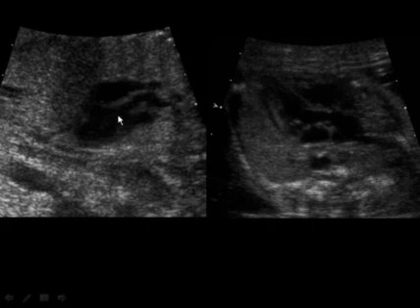The issue is that the superior and inferior walls of the aorta are normal even when there's an overriding aorta. It's the medial wall of the aorta that we care about, and you can't see the medial wall of the aorta when you take an image in this plane. So the medial wall of the aorta is in here somewhere. The better technique for imaging the aorta is to start on the four-chamber view, stay in the axial plane, and follow the interventricular septum up so you see the medial wall of the ascending aorta. You know you've done that if you keep the right ventricle and the left ventricle on the image at the same time as you follow the ascending aorta out. This continuity between the interventricular septum and the medial wall of the aorta excludes with confidence an overriding aorta and tetralogy of Fallot.